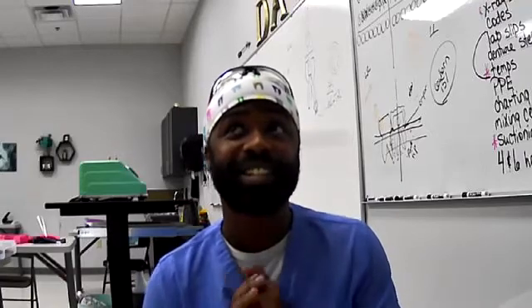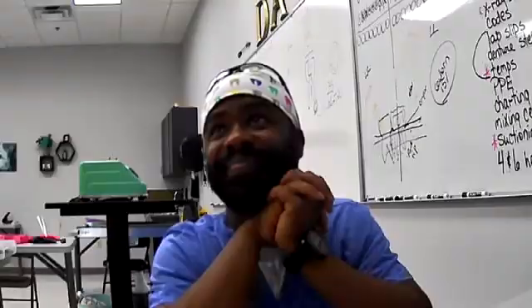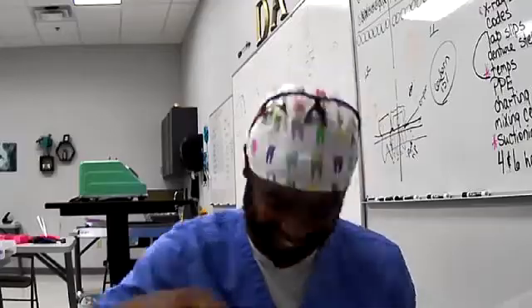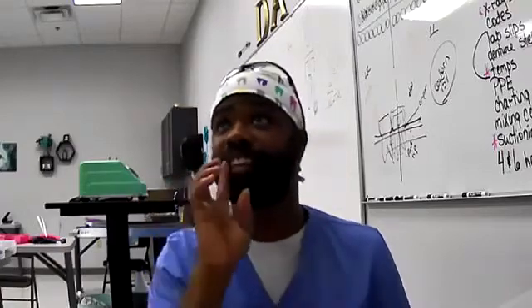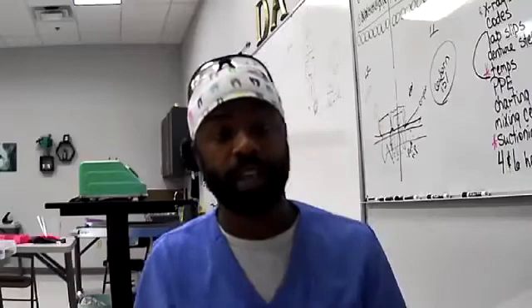what do you use for the anterior teeth if you're doing a restoration? I know it's like a piece of plastic. I know what you mean. The mylar band. Remember the mylar strip, the clear strip? Yeah. Okay. The mylar strip, mylar band, whatever they call it at the office you go to.